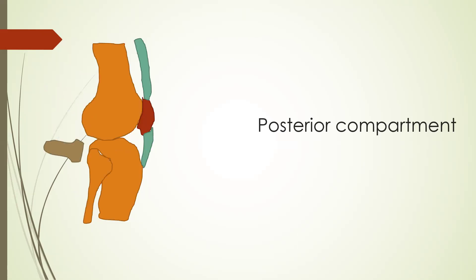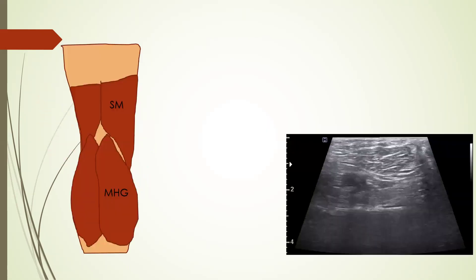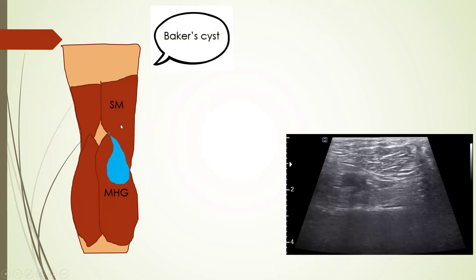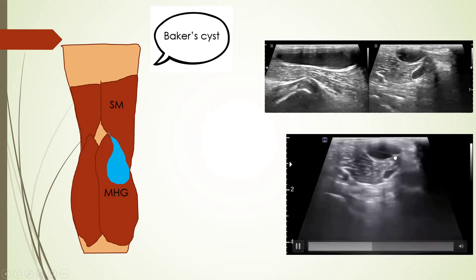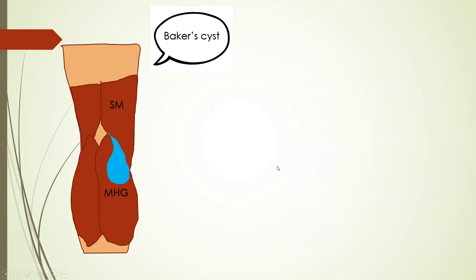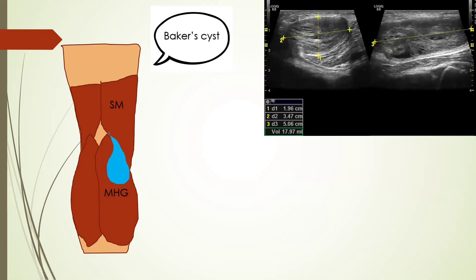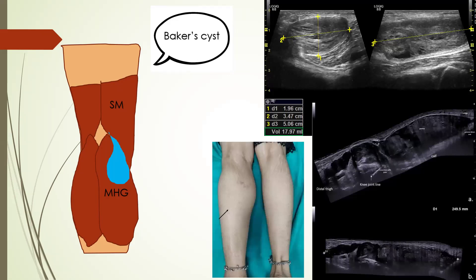Moving to the posterior compartment, one of the most common pathologies around the knee joint is Baker's cyst, which is distension of the bursa between the tendons of semimembranosus and the medial head of gastrocnemius. It gives a sign known as the speech bubble sign, which we can see here between the tendons of semimembranosus and the medial head of gastrocnemius. Baker's cyst can be echo-free or filled with synovial thickening, as in this case of rheumatoid arthritis where exuberant synovial thickening and large pannus is distending the Baker's cyst.